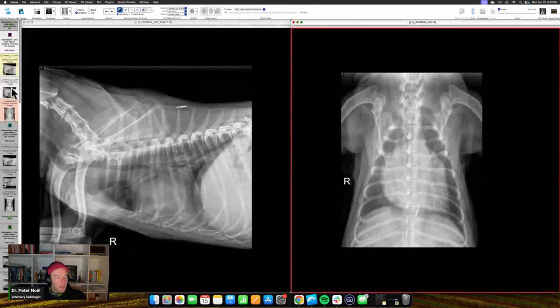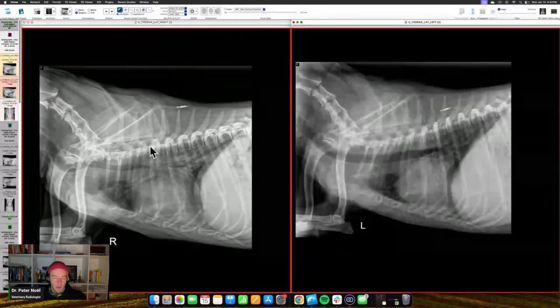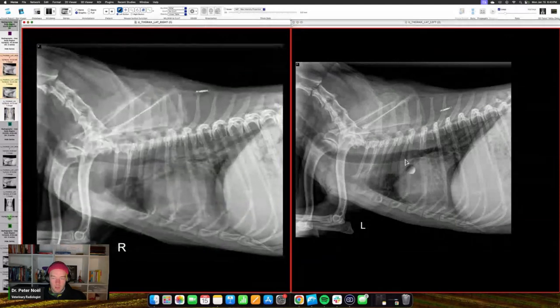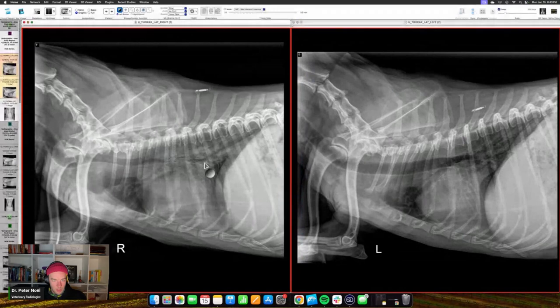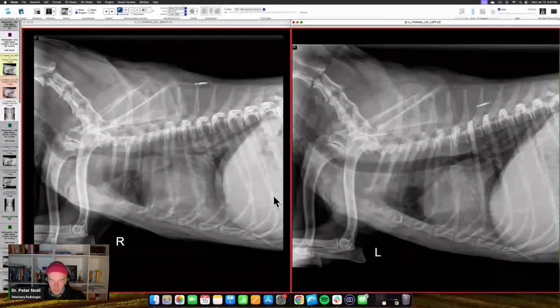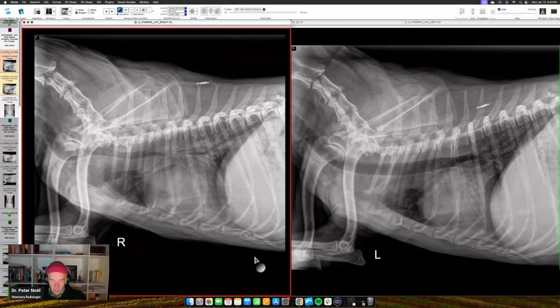By the way, I should put up a little quick video about what I use to look at the radiographs. I use Horos. I'm on an iMac Studio. The only reason I'm on a Mac is because it had this nice combination of size of the monitor. I'm on a 27 inch, but I don't think you need that. A 21 inch iMac would be great, but I'm on Horos. It's free, and it allows you to window and level and do this sort of thing.